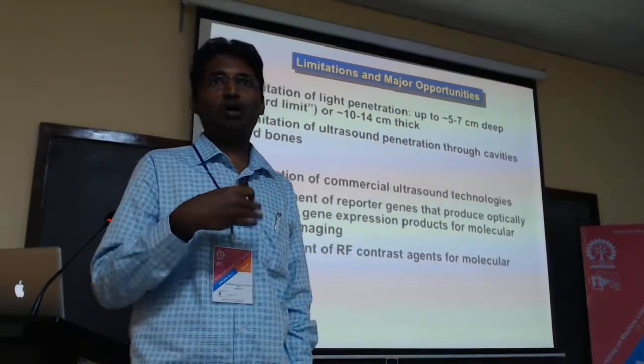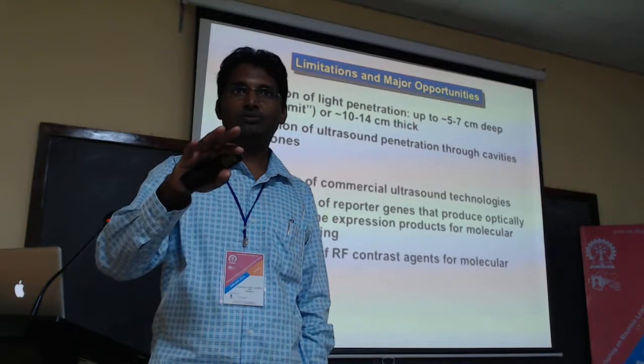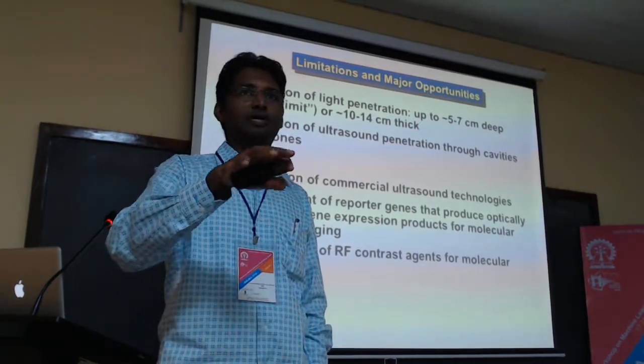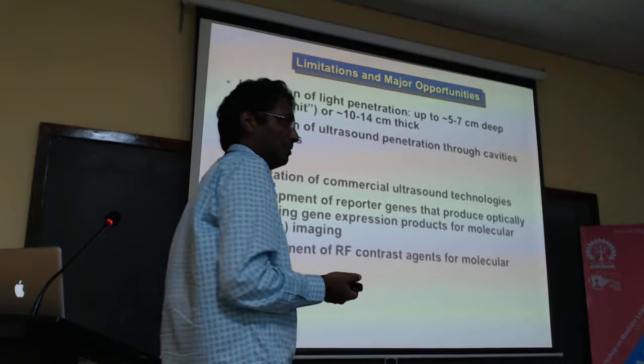Can we come up with optical clearing approaches, where you combine photoacoustic imaging with optical clearing so that you clear off the tissue on top? You're not really cutting it off, but you use these drugs so that it clears optically, and then you use that, right? Now, limited ultrasound penetration through cavities and bones has been a major limitation.